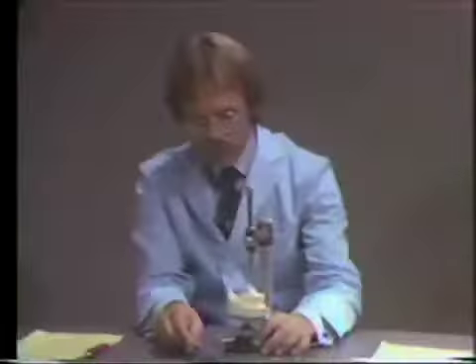So I will choose this slightly forward tilt from the neutral position as my final design and my final position for surveying. Now I want to be able to position this cast again in this same position if I take it off the surveyor.